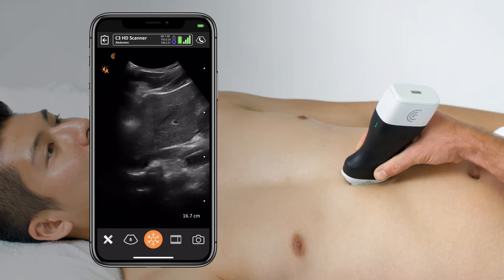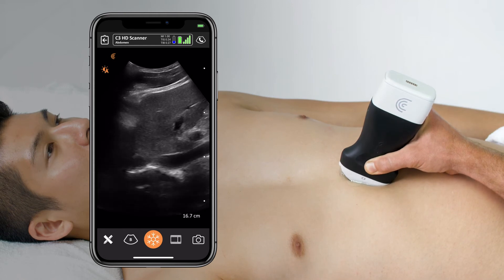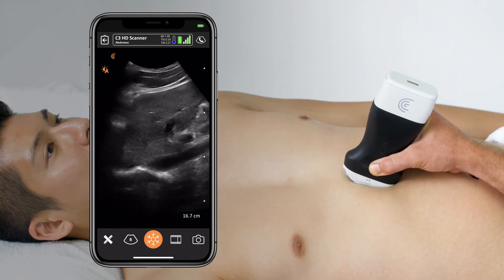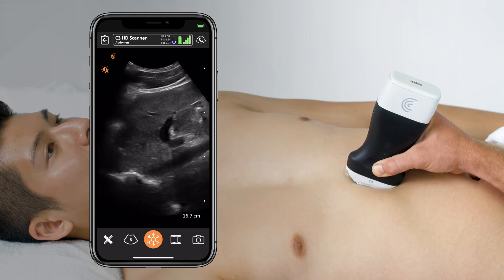Some slight rotation may be required to make sure I'm really on the axis of that IVC. And once I see a good view that's very clear of the IVC's two walls on the anterior and posterior.